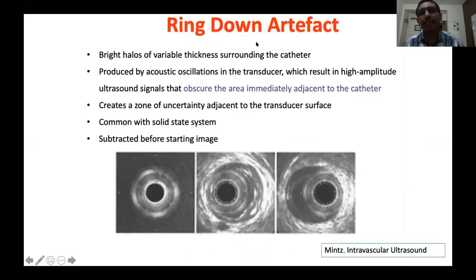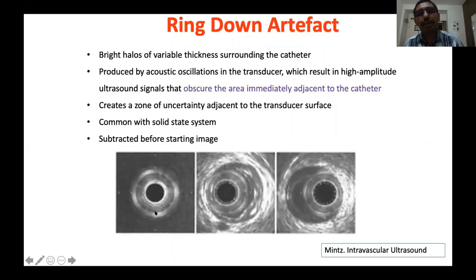Ring down artifact: bright halos of various thickness surrounding the surface of the catheter — the typical ring down appearance. It results from acoustic oscillation at high frequency closer to the surface of the transducer. The clinical importance: it creates a zone of uncertainty. In a bigger vessel it doesn't make much difference, but when imaging a smaller vessel this ring down impairs your capacity to identify abnormalities closer to the vessel. The system provides a ring down suppression function that removes this ring, but still suppresses information closer to the catheter.